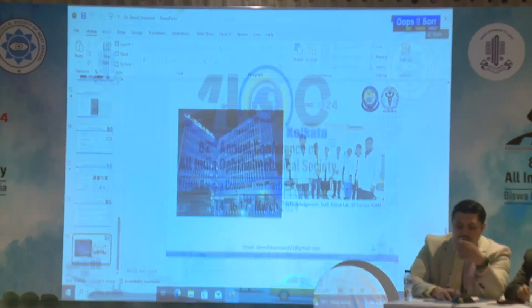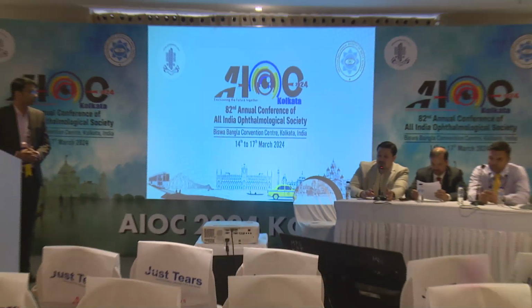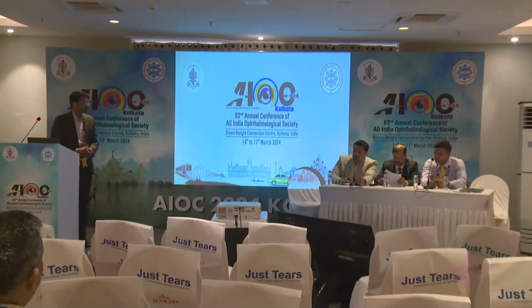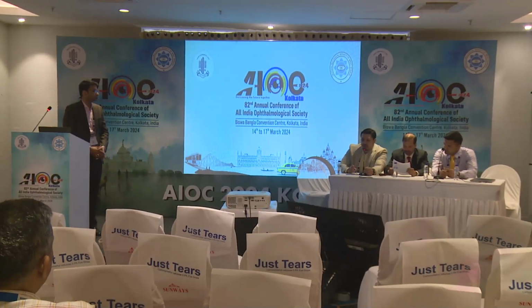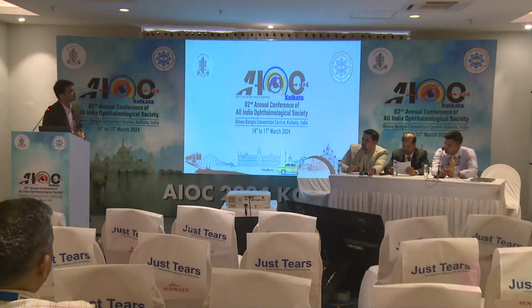Thank you, Dr. Devesh. I would like to thank you that you have summarized all the basics of OCT angiography very crisply. Just one question that I wanted to ask you.